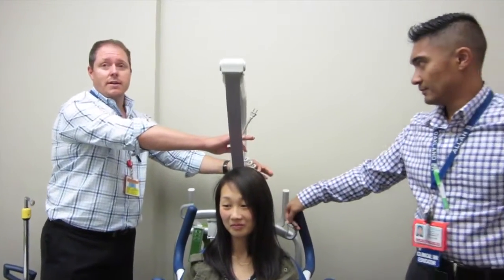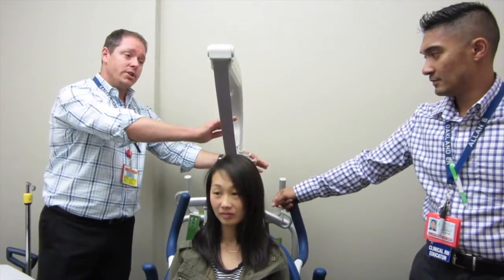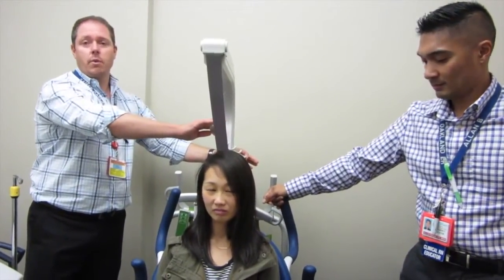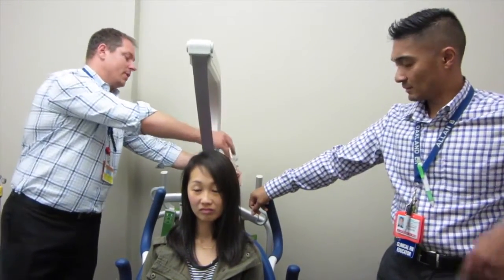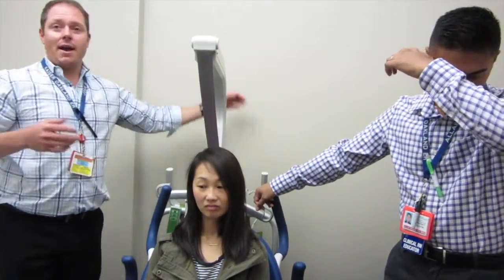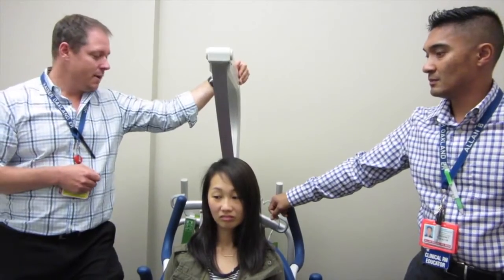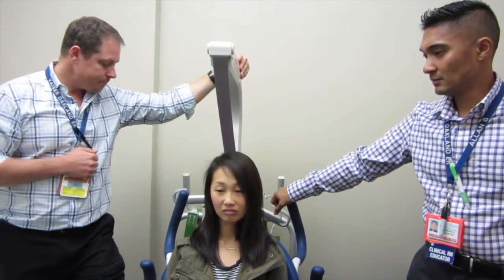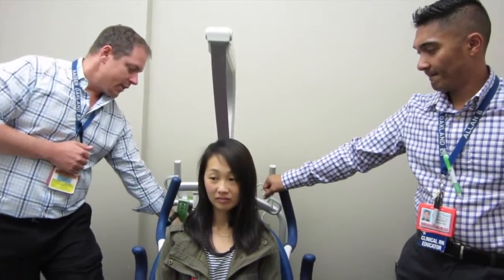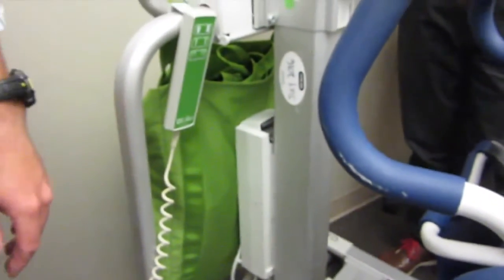And then the other thing that is always a fooling kind of element with the Golvo is that it doesn't work if it's plugged in. You have to always leave it plugged in when you're not using it so that it's charging constantly, but when you actually do use it, you cannot use it if it's plugged into the wall. It's designed to do the entire lift up and down off power. That way you would never get a patient up into the air and not have enough power to get them down or complete the lift essentially without plugging it back in. So it'll not work when you have it plugged into a wall. That's one of the tips about the Golvo. There's a battery pack here that's kind of hot swappable, but for the most part we just plug it in and keep it plugged in so that it's always ready to go when we need to use the power. And that's it. Let's go for this lift.